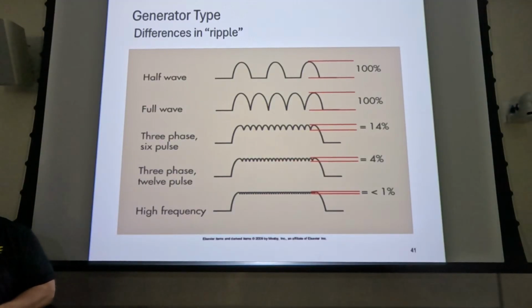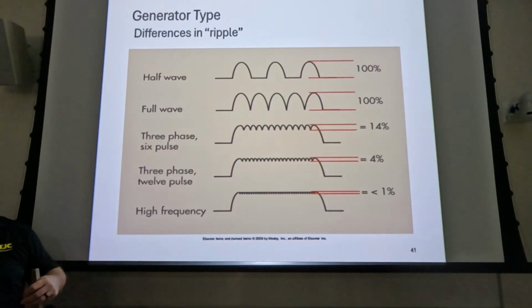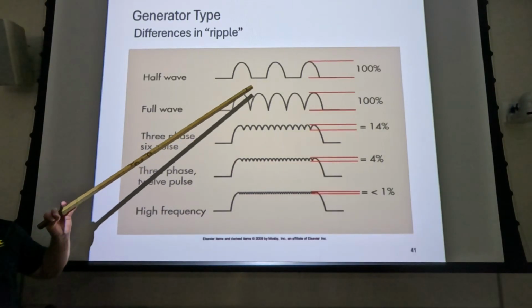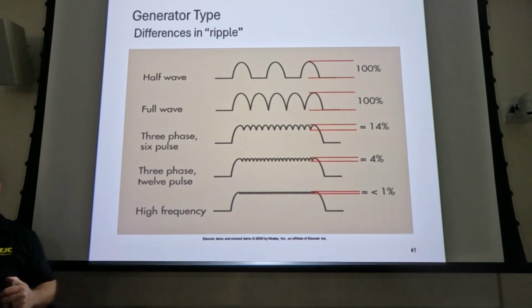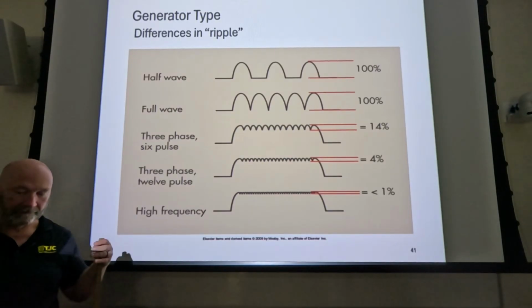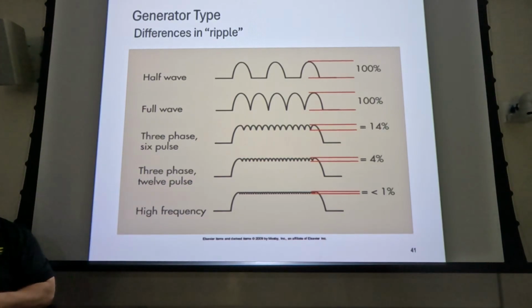Yeah, that's a pretty good average, right? And then, of course, down here, if you know you're at 99 and 100, then your average is extremely high. So what happens when we change waveform? We go from single phase to three phase. Our average goes up. Also, we get an increase in the numbers, the output from the X-ray tube. So our bubble goes up and it pushes towards the high energy side.